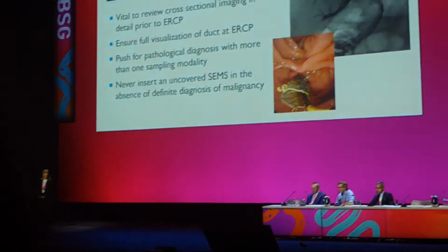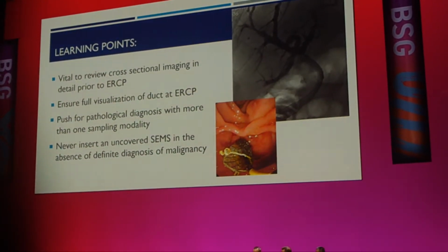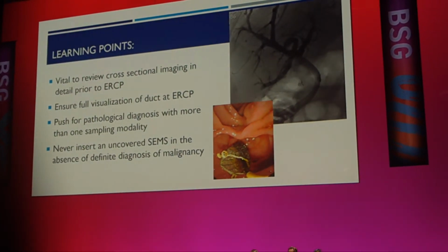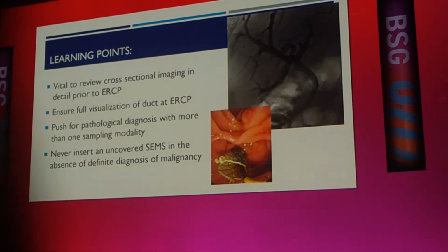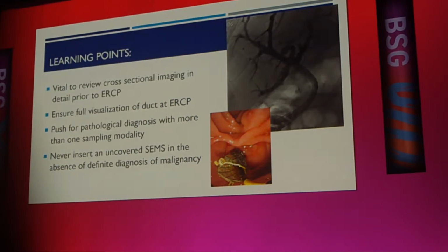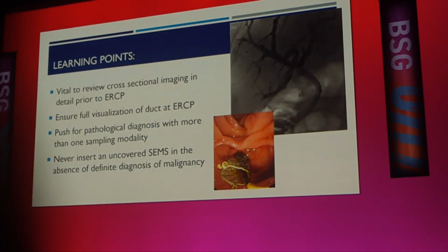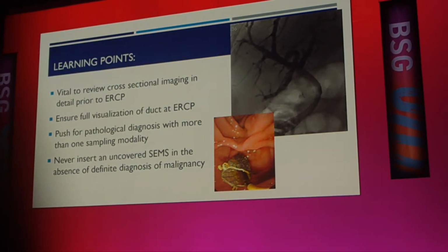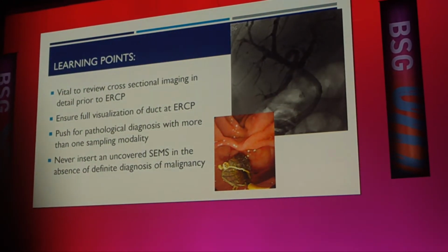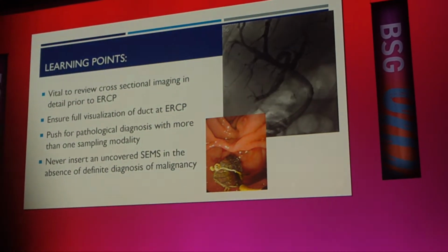Yeah, thanks, George. Maybe I could just ask you to take us through your final slide, and then we'll finish with one or two questions. Yeah, so a few little points. I think it's absolutely vital that, well, actually, almost every patient having a biliary intervention or an ERCP, cross-sectional imaging has to be reviewed beforehand, particularly if it comes to tissue stricture assessment.